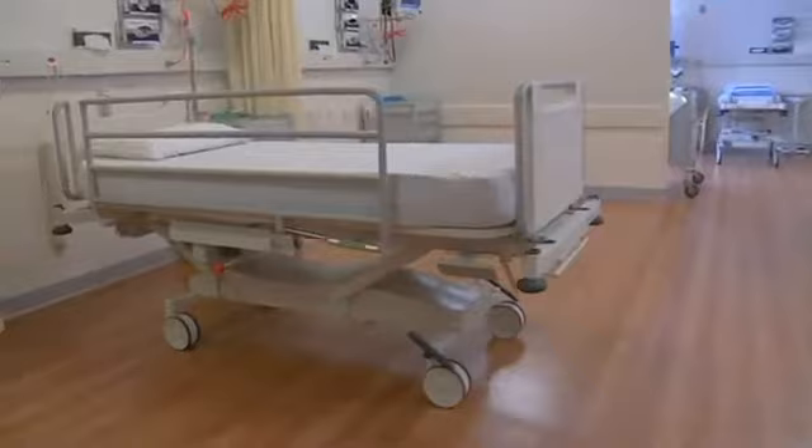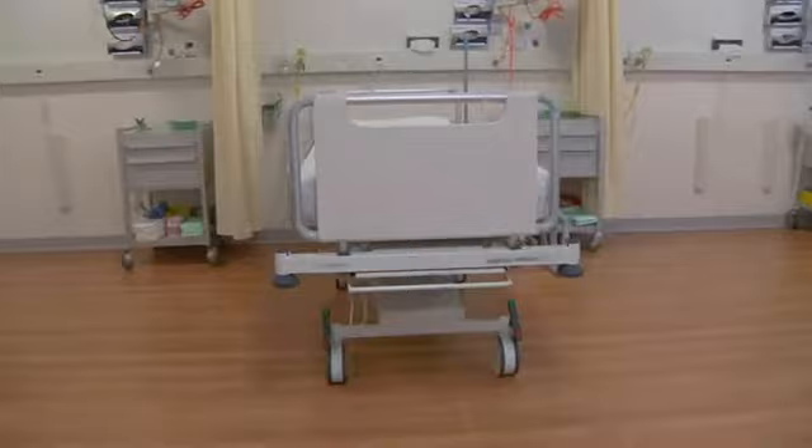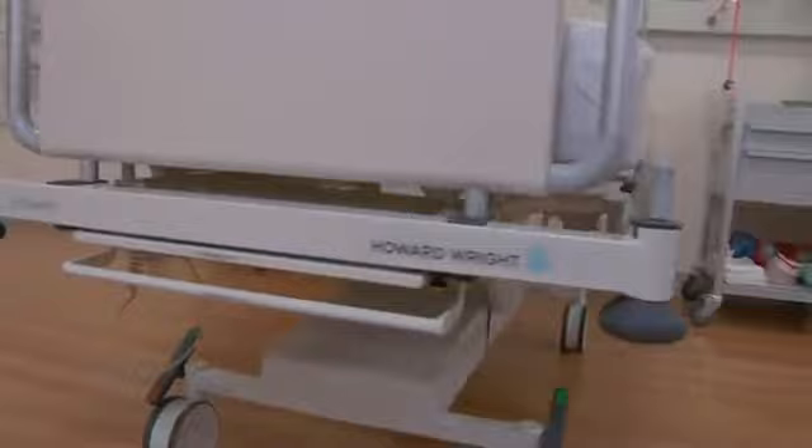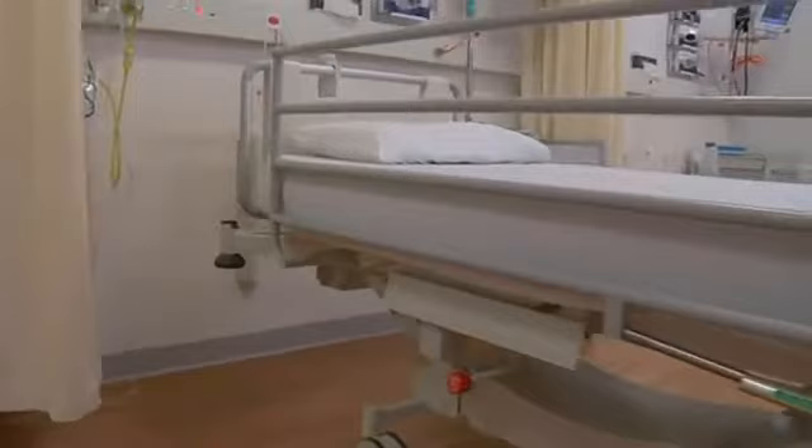Introducing the M9, the next generation in Howard Wright's lineage of innovative and efficient medical beds and stretchers. The M9 has evolved from Howard Wright's hugely popular and successful M7 range, which has become a bed of choice for medical facilities throughout Australasia.